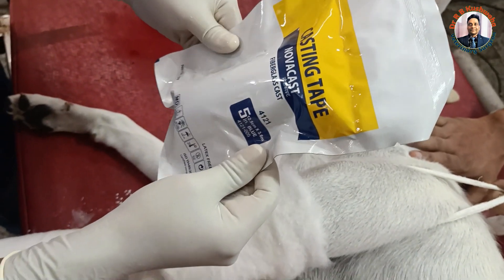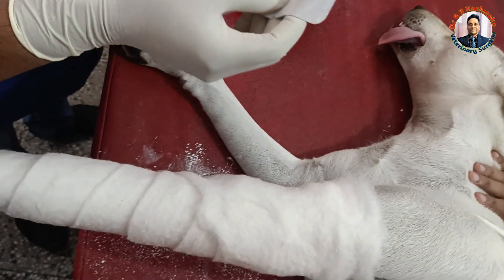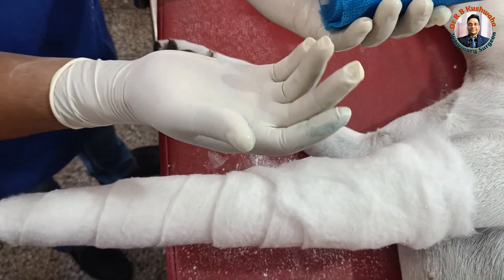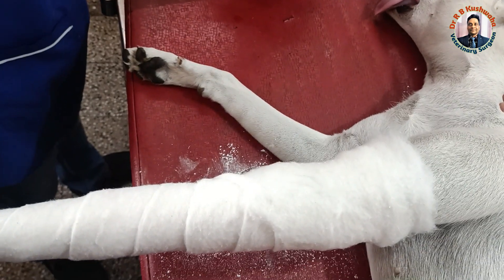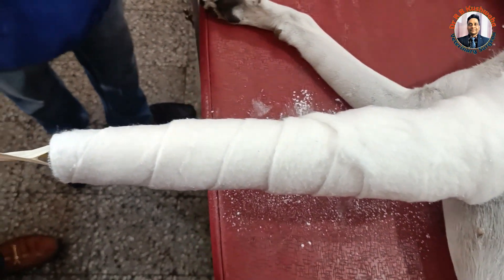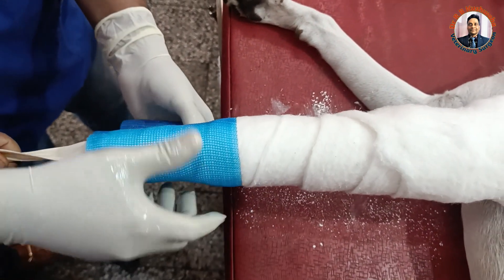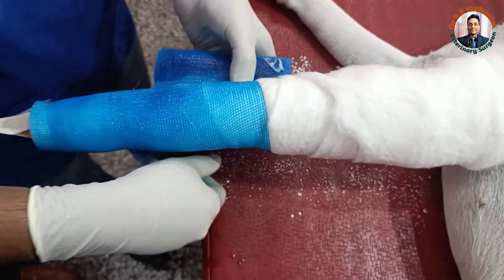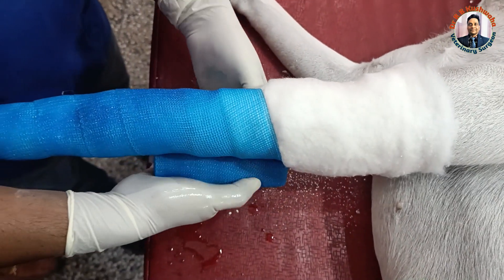This is the Nova Cast fiberglass casting tape — Nova Cast fiber glass cast, 5 inch. Normally in case of a dog we apply the 2-inch size, but due to unavailability we are using this. The surgeon or applicant must wear gloves, otherwise the fiberglass will adhere strongly over the skin. From here onward we again start from the distal end with gentle pressure — we should not apply too much pressure. We follow the rule of 50 again.